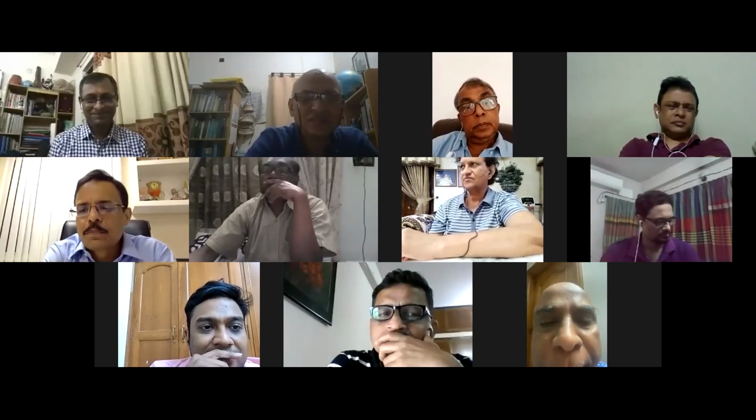First of all, should DSA be a routine investigation in all ischemic stroke? This is number one. Number two, when do you decide not to intervene in a major vascular occlusion?